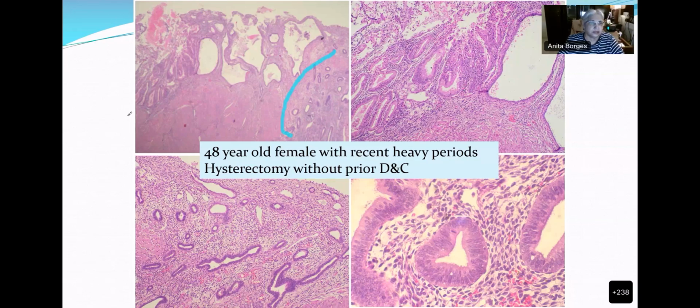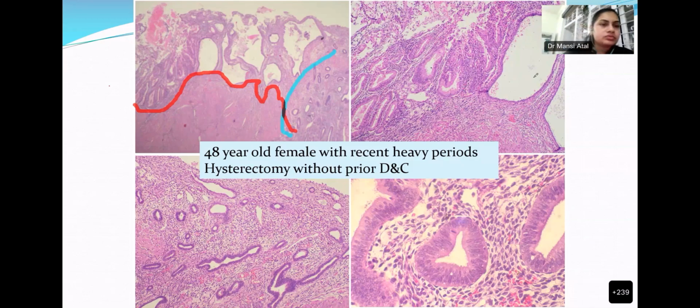All right. Can you see here that there is the endometrial myometrial junction? Yes, ma'am, there is the endometrial myometrial junction. Okay, and I see three zones because everything superficial to that is the endometrium, right? Very good. So in this zone where I have outlined it, what do you see here, Mansi? Does it look like this zone? You only describe this zone, but I see zone number 1, this is zone number 2, and I see zone number 3.